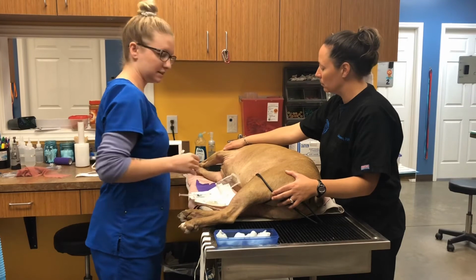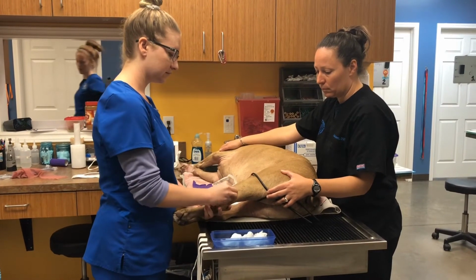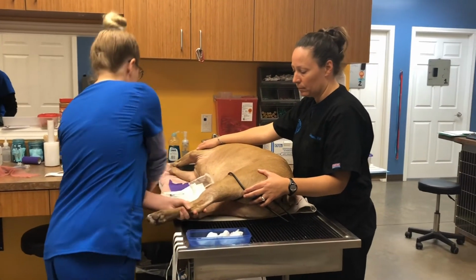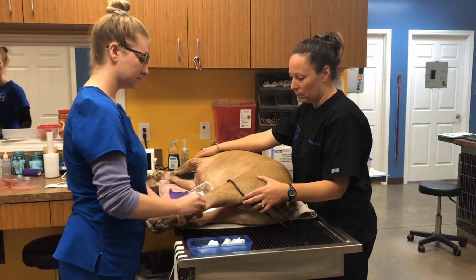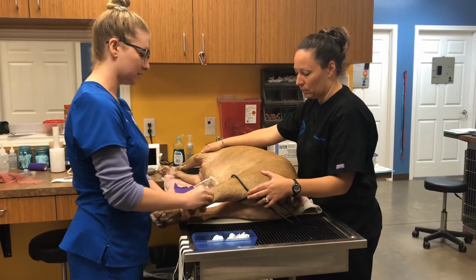And then I'll go in and start cleaning my site. So I'll start with some chlorhexidine scrub. You want to start at the center where you're going to place the catheter and work your way outwards so that the center is the cleanest part. We'll rotate between chlorhexidine and alcohol and do that a minimum of 3 times.